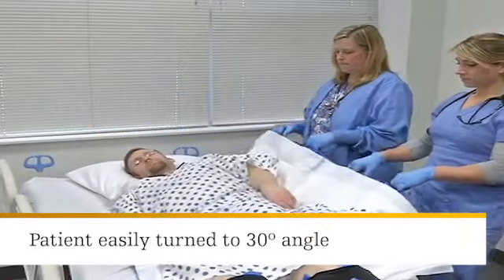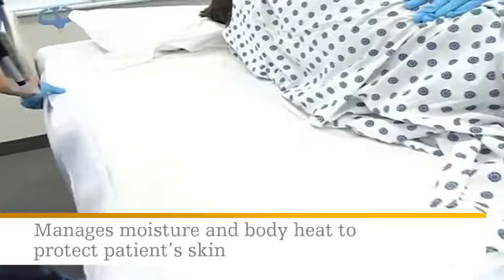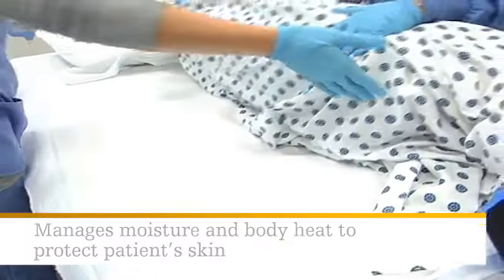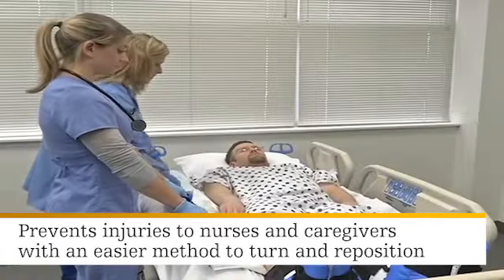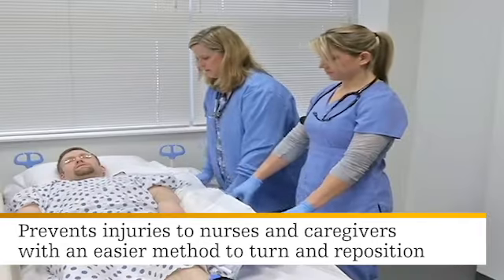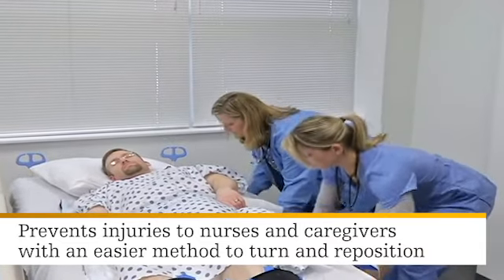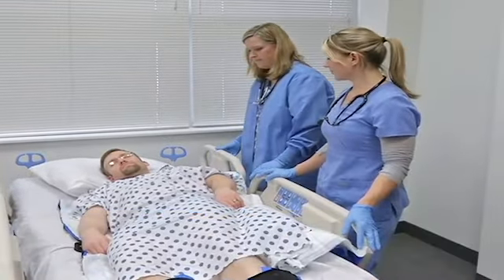The system allows the patient to be easily turned to a 30-degree angle. It also effectively manages moisture and body heat to protect patients' skin. In addition, it helps prevent injuries to nurses and other caregivers by providing an easier, more ergonomically friendly method of turning and repositioning patients, which also helps increase compliance to turning protocol.